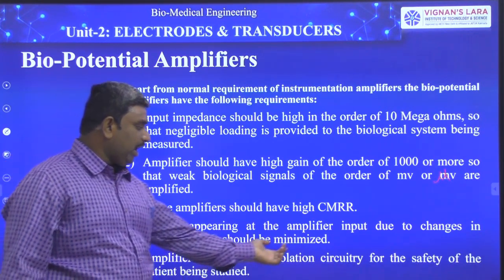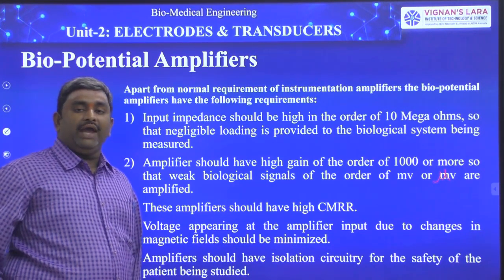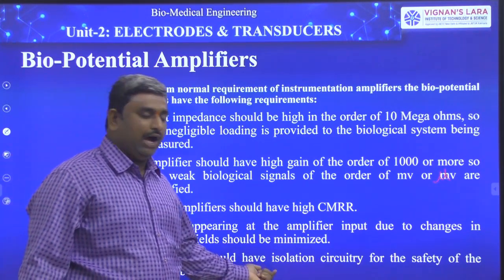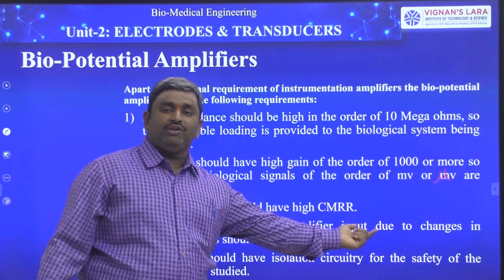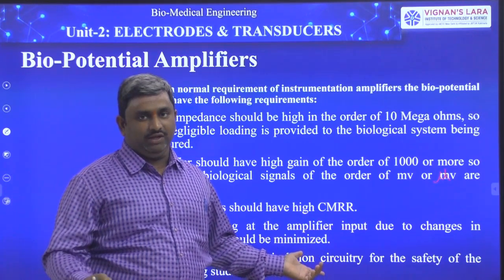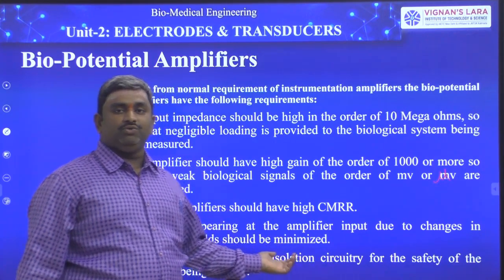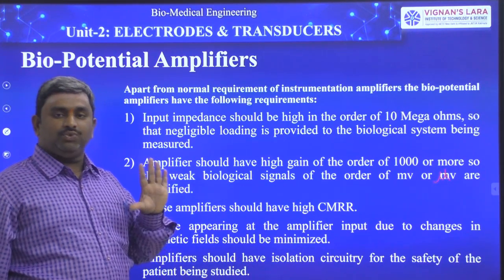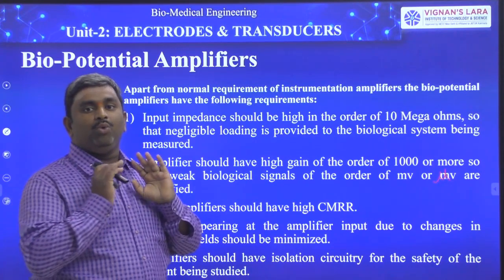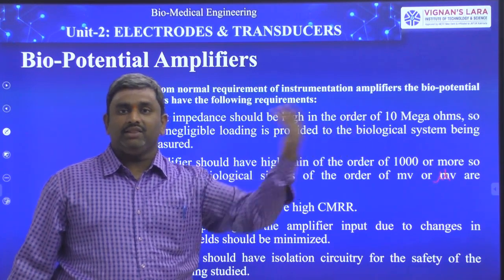Next, amplifiers should have isolation circuitry for the safety of the patient being studied. For the safety of the patient, we are providing double safety, which we call isolation circuitry. What is meant by isolation? Isolation means there is entry from only one side; the other side entry is not available. It is like a one-way road: we can enter the road, but we cannot come back on the same road.